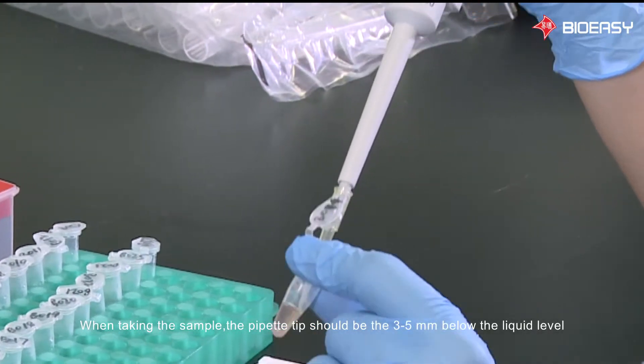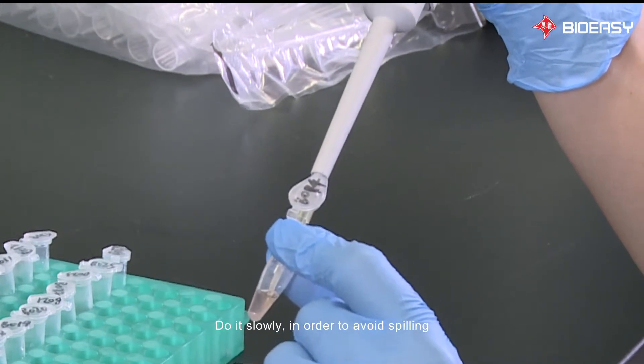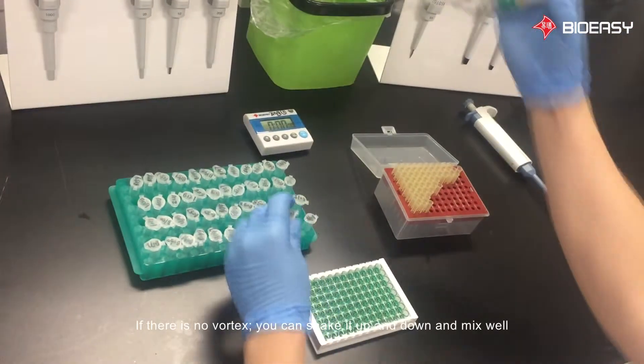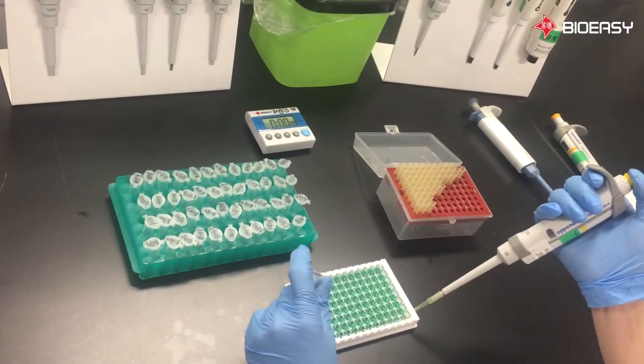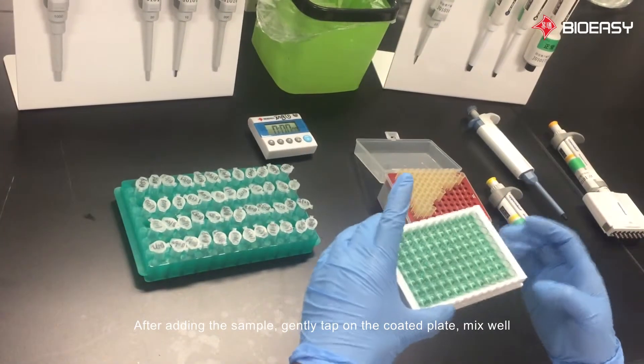When taking the sample, the pipette tip should be 3 to 5 millimeters below the liquid level. Do it slowly in order to avoid spilling. If there is no vortex, you can shake it up and down and mix well. After adding the sample, gently tap on the coated plate to mix well.